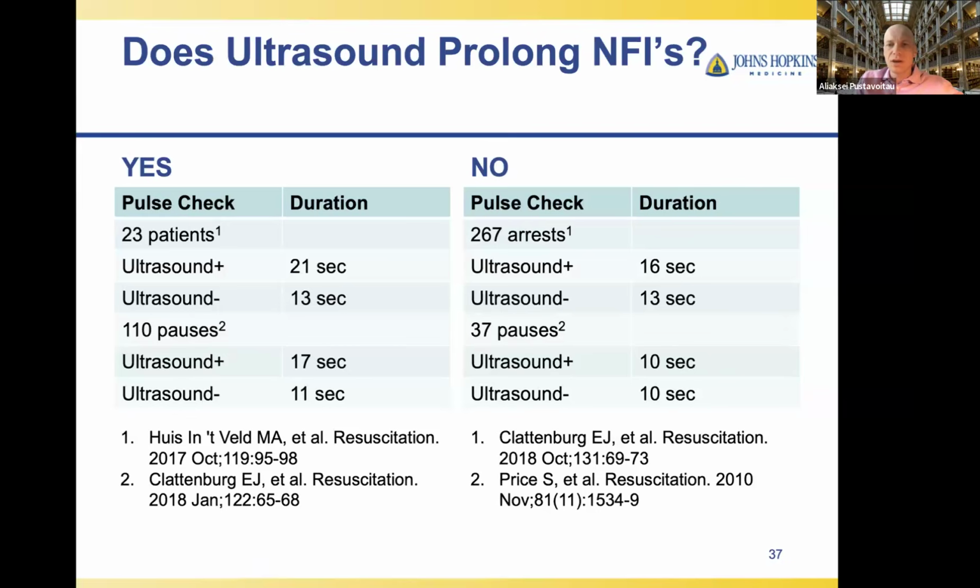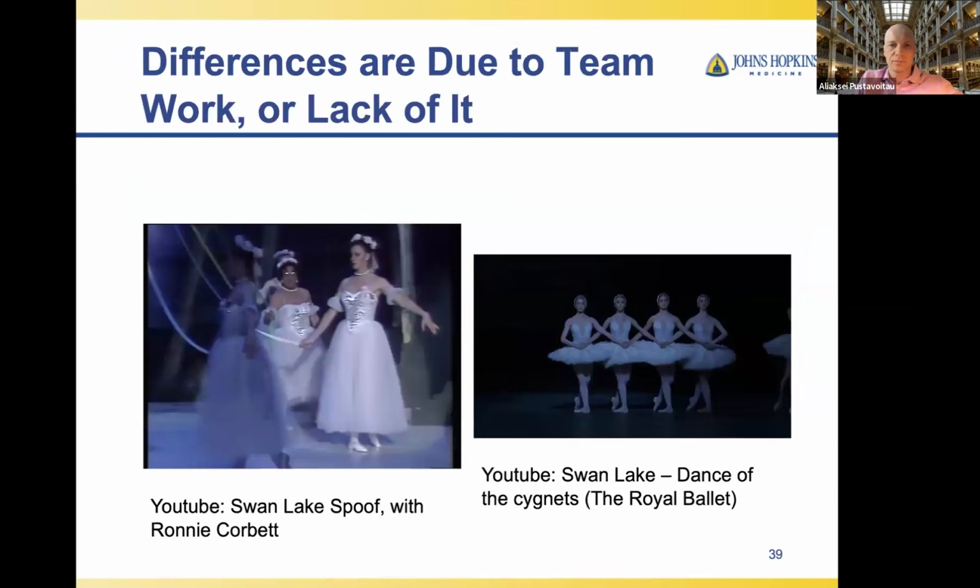And there are studies that say no, it doesn't really prolong. When you actually read those studies carefully, in the ones that say no, all trainees underwent specific training before they started using ultrasound for cardiac arrest. And the training is what made a difference. It's not the use of ultrasound per se, it's actually how you use it and what you do about it.